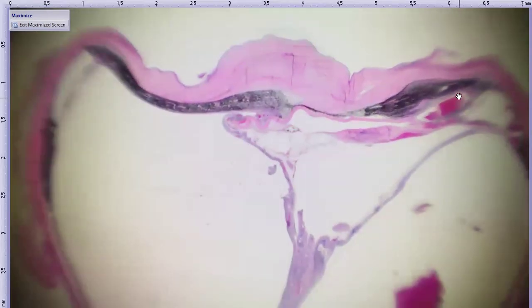There is hemorrhage in the posterior chamber. Here is what's left of lens. You can certainly identify the anterior lens capsule there. And then here's this collagenous plaque that's on the back, or well, kind of, it's hard to tell whether it's in the lens here on the back of the lens. And then the retina is diffusely detached and variably atrophied. And back here we have the optic nerve head, which is distorted by the detached retina.